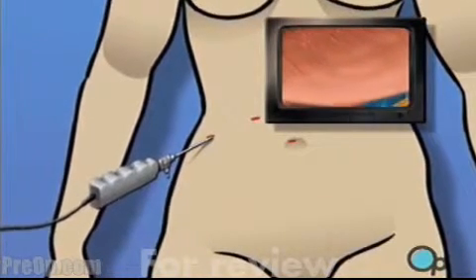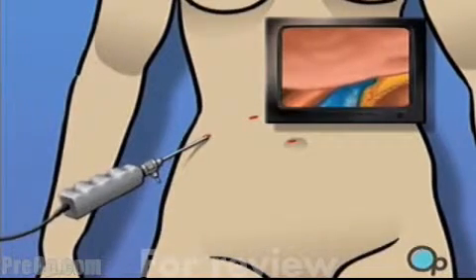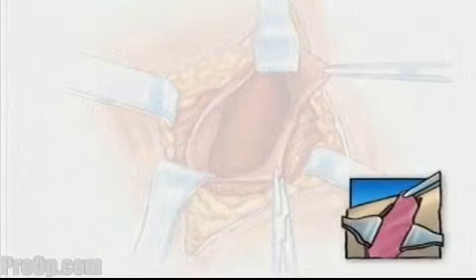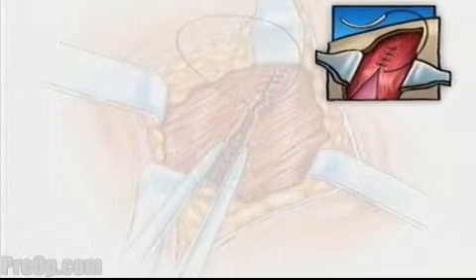However, it is important to understand that during the procedure, your surgical team is always prepared to convert a laparoscopic procedure to an open procedure, should they feel that your condition requires a more direct approach. If the surgical team makes this decision, you will find upon waking up that your doctor has made a larger incision and that healing may proceed more slowly. Converting to an open procedure will affect the length of your recovery and will probably require hospitalization.